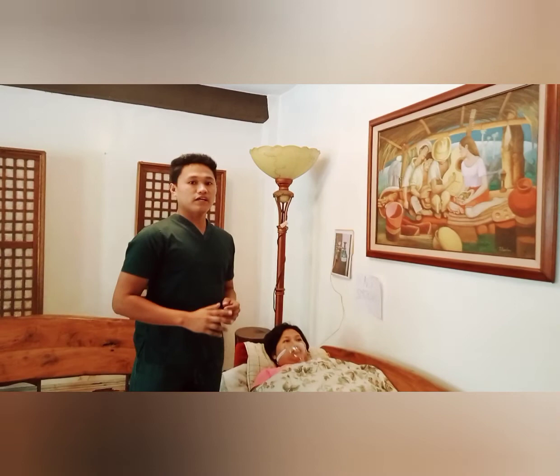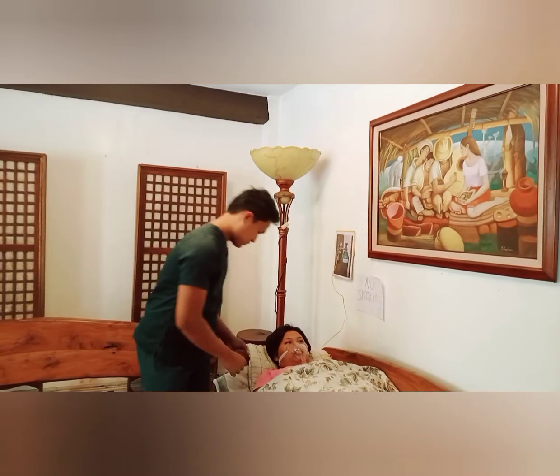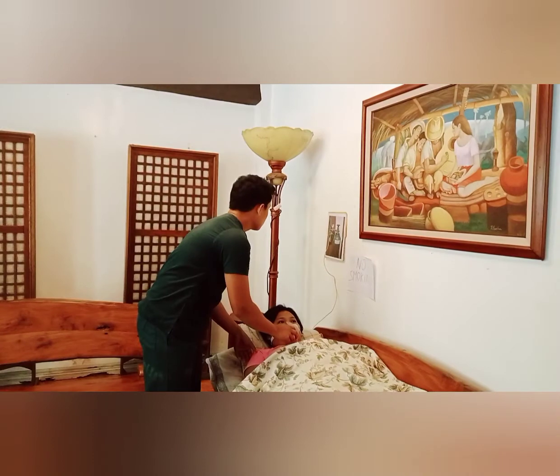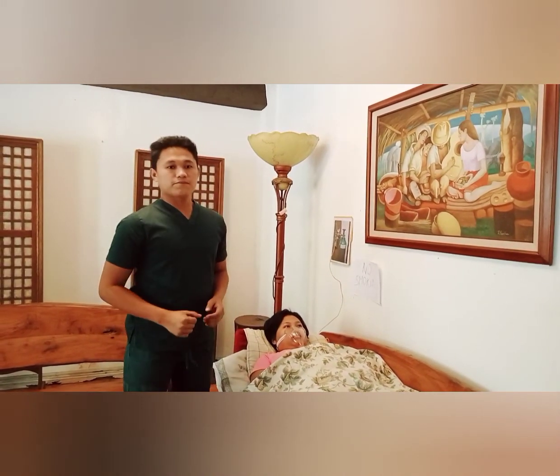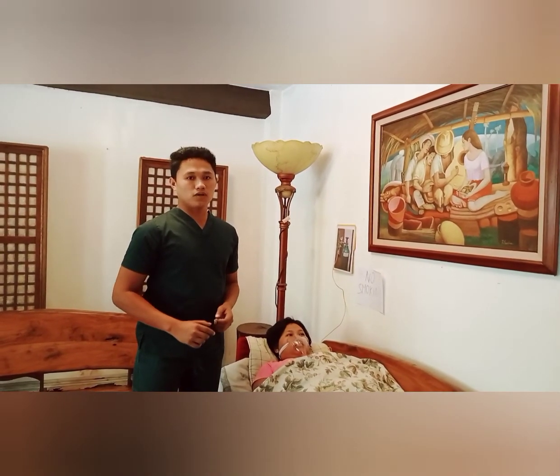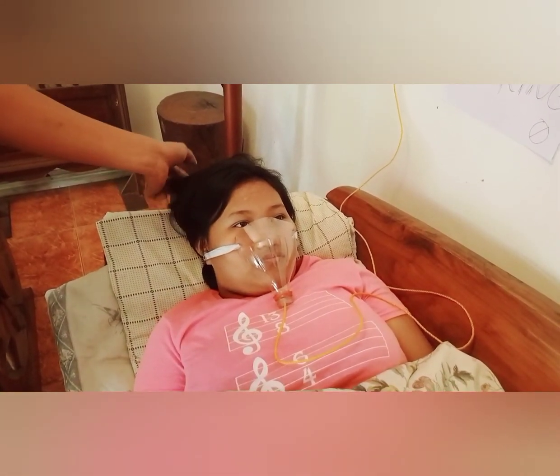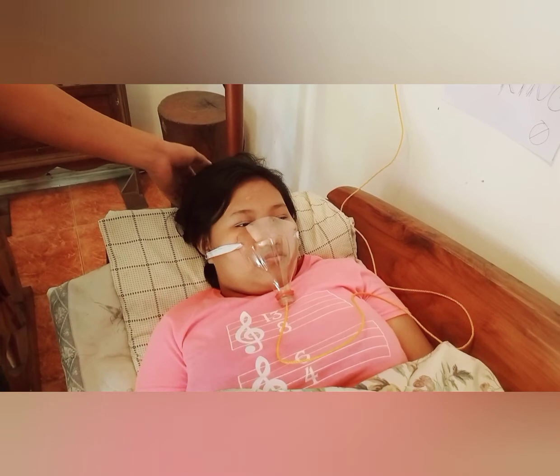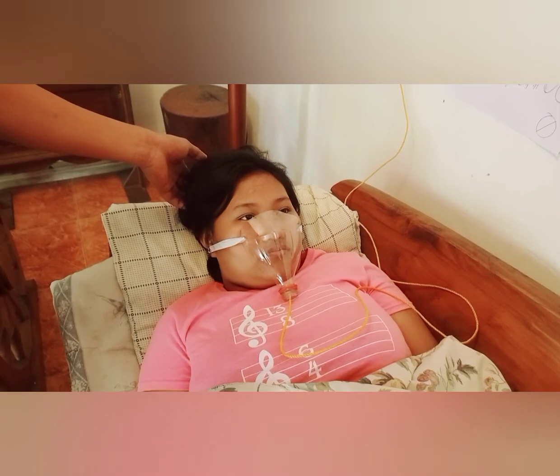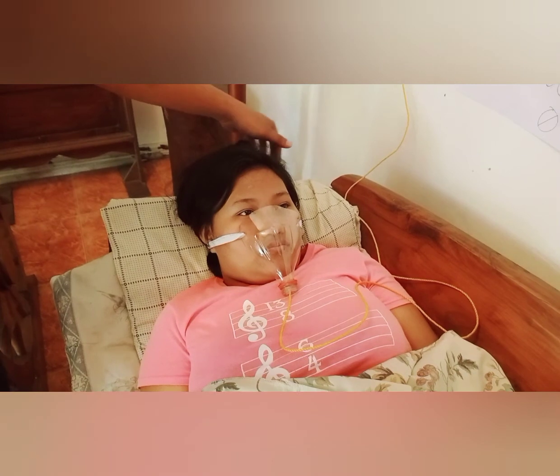So now I will check the client's respiration and pulse, to monitor respiratory condition and to find out abnormalities as soon as possible. Okay, then lastly, I check the reddened pressure areas under the straps. The straps must not place pressure on the underlying skin areas of the client. So we are going to check the reddened pressure areas of the client.